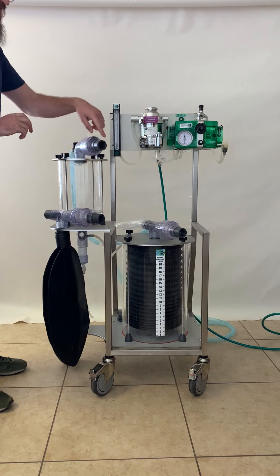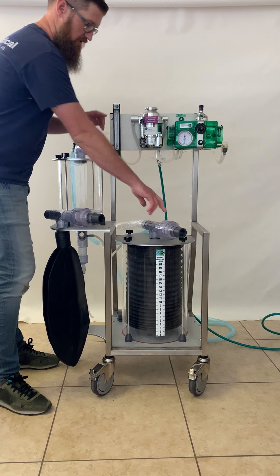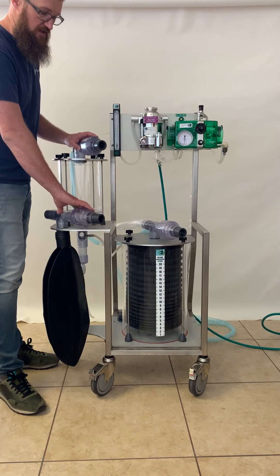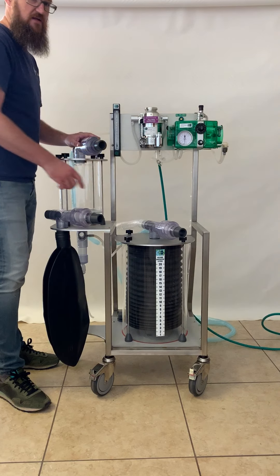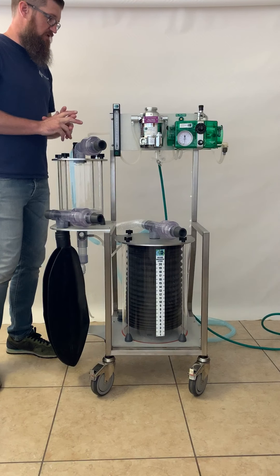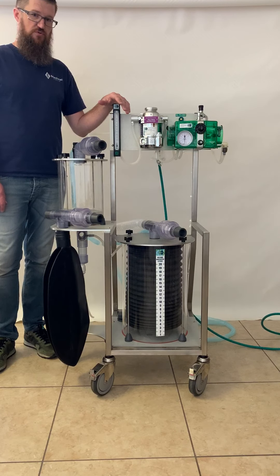The valves are labeled with directional arrows — inspiratory and expiratory. There is an extra inspiratory valve included; if you're only using the ventilator and this valve goes bad, it can be swapped temporarily to get things going again. Everything else is pretty straightforward. If you have any questions, please let us know. Again, I'm Joe with JD Medical and I hope you've enjoyed the video.